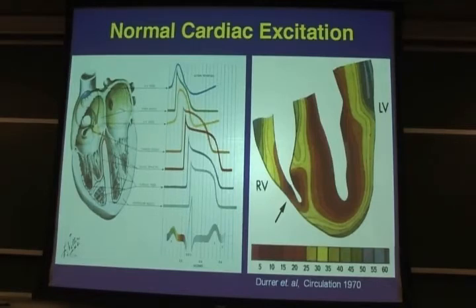So there will be a hole formed in the activation wavefronts that is really observable in all of our reconstructions in normal human beings at around 21 milliseconds from the beginning of the QRS of the cardiac cycle.